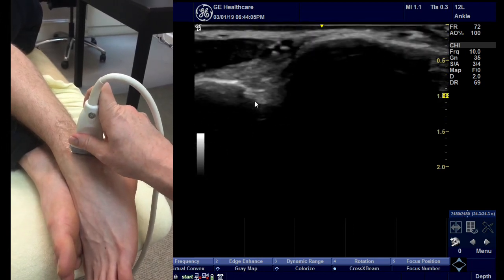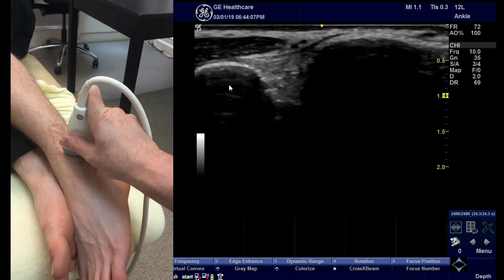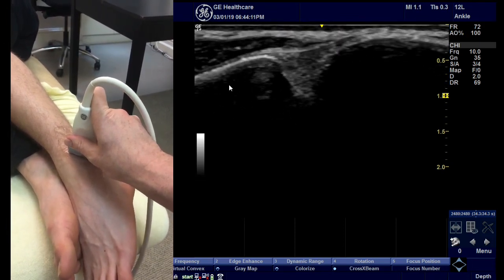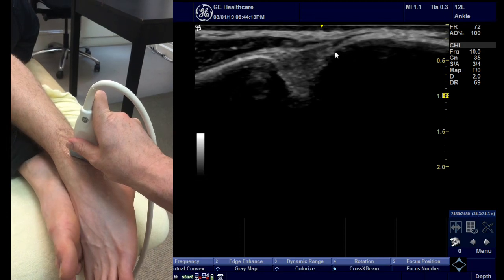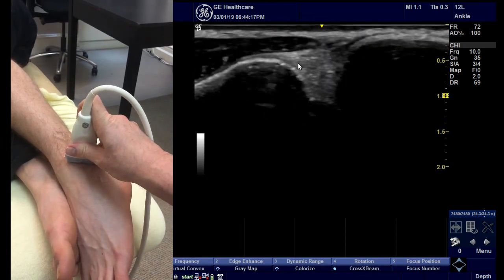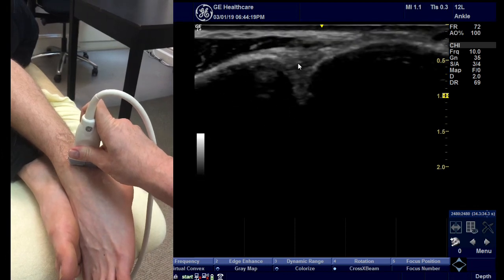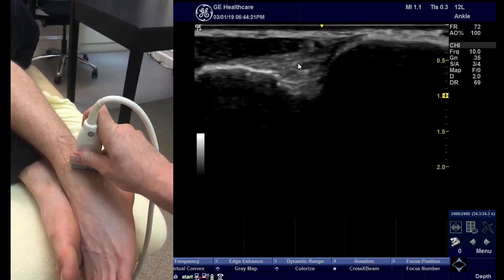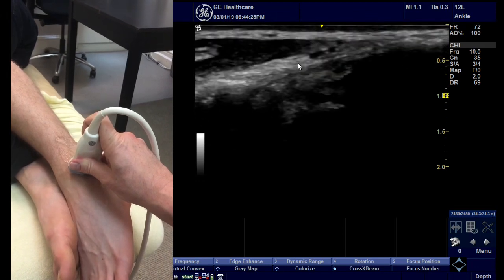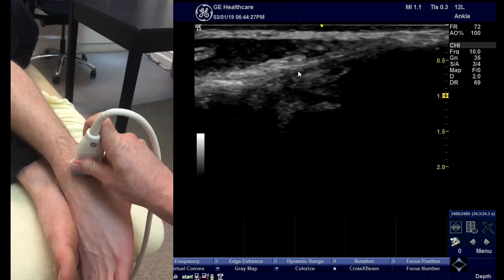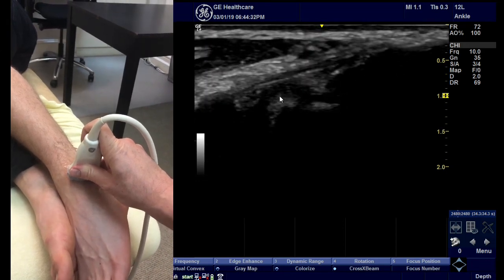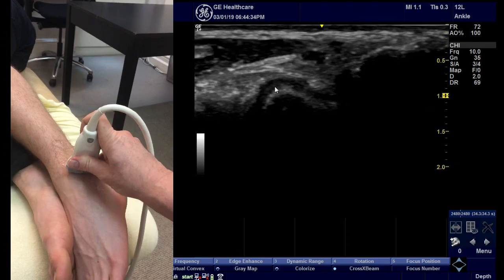You then angle the medial end of the probe, which is on the left, up again until the AITFL comes into view between the two bones. You scan through the AITFL in its long axis, coming inferiorly so far as you see the most medial band — this is the one that can impinge on the corner of the talus dome there.